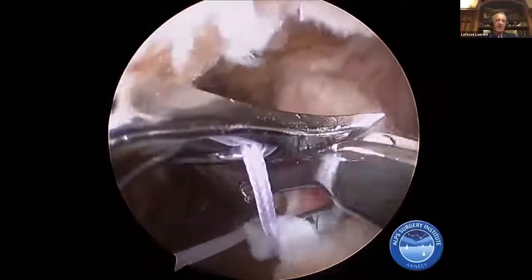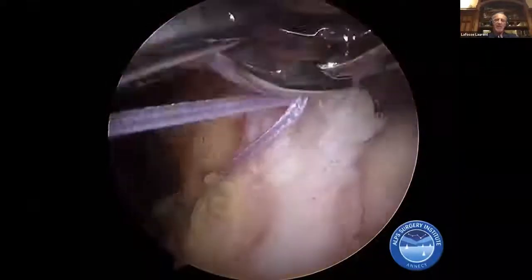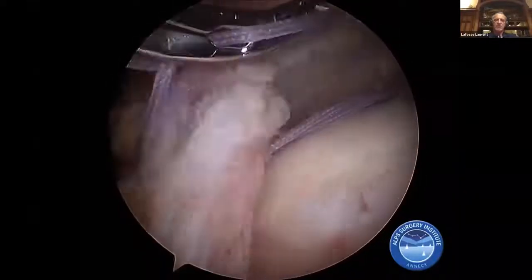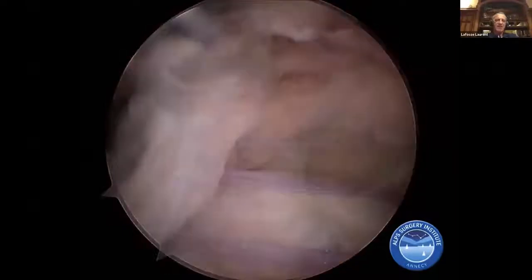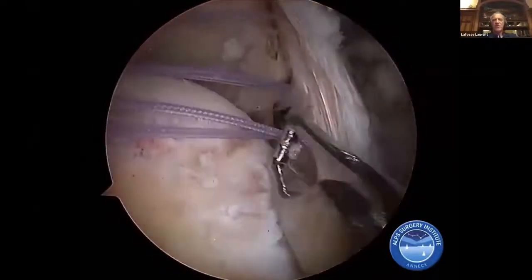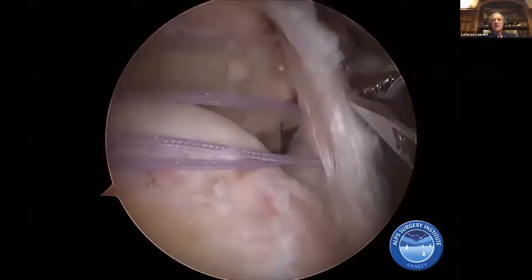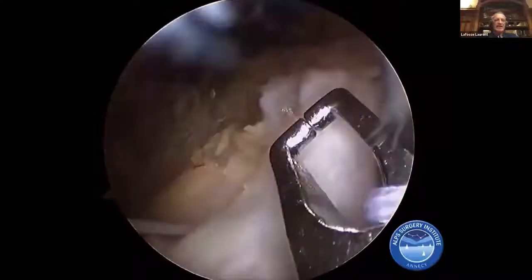And look, this loop, I will take the suture which is on the back and go through the loop with the suture on the back. And this is the running suture. You see 1, 2, 3 loops coming from the front, and the running suture which is straight going through each loop on the back.